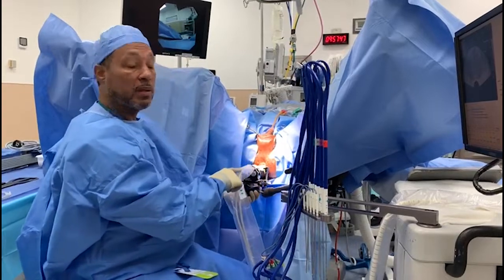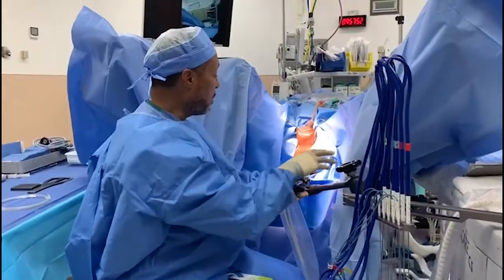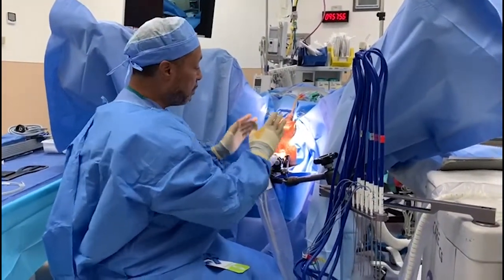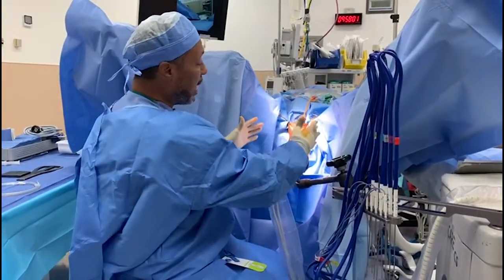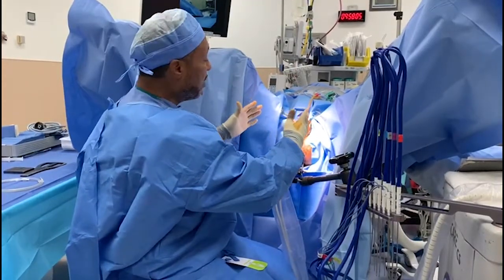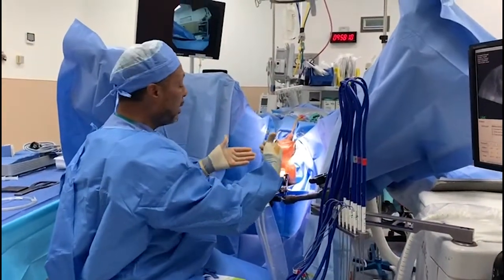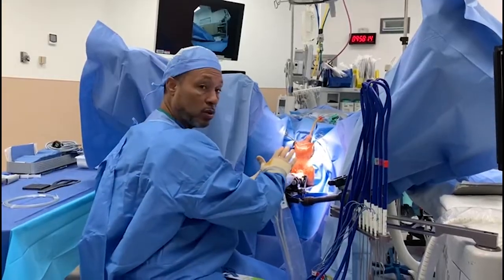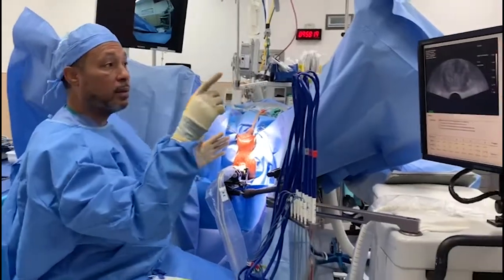I'm going to demonstrate placement of the probe. We have a stepper here, which is your standard stepper. Positioning is critical to the procedure itself. You want to have the patient completely lined up, perpendicular, and then have the table in that exaggerated lithotomy position to bring the prostate home. With the stepper, we want it to go straight in so it's very straight when you look at the ultrasonic image.